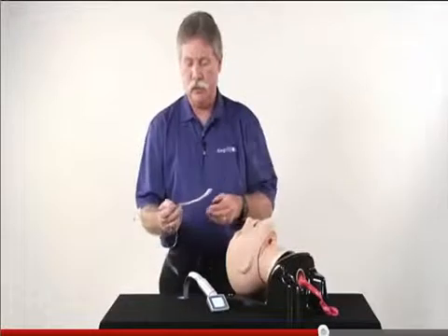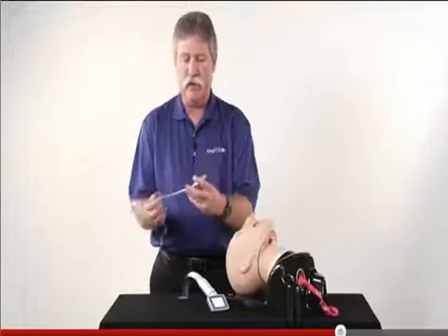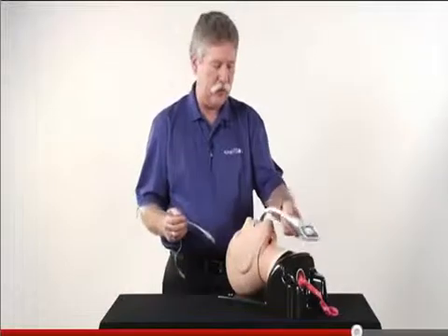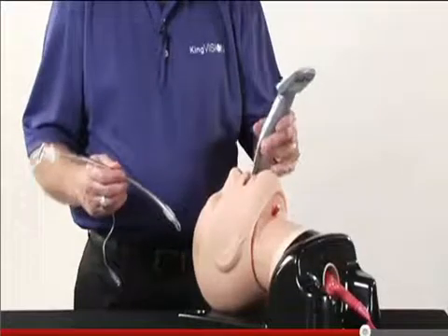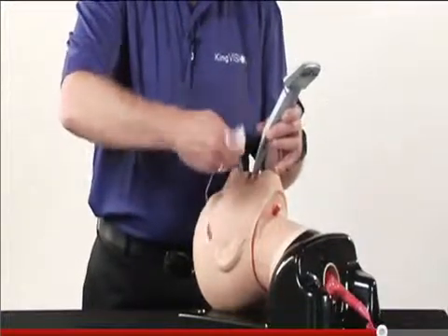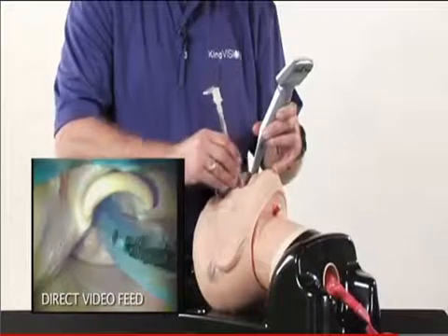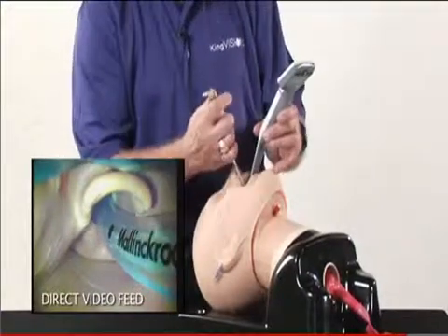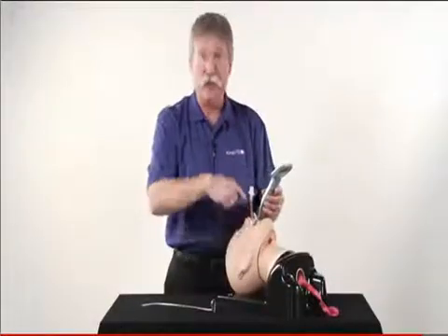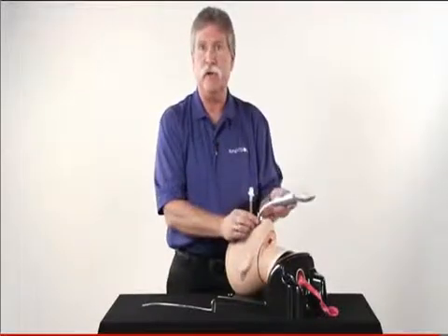An alternate insertion method would be to use more of a retromolar approach, which doesn't require as much curvature, because you're cutting the corner, so to speak, rather than following the blade curvature. So again, placing the tip, visualizing the vocal cords, but now you're kind of coming in from the corner of the mouth, outside the molars, and if there is sufficient room in this patient, you can actually get more of a straight shot, which makes it a little bit easier to deliver the tube in some cases. Both of these techniques, following the curvature of the blade, shaping the stylet accordingly, or using the retromolar approach, have been used very successfully.